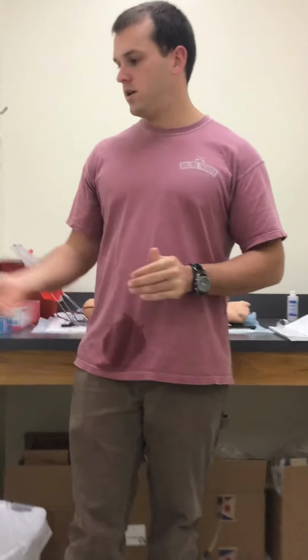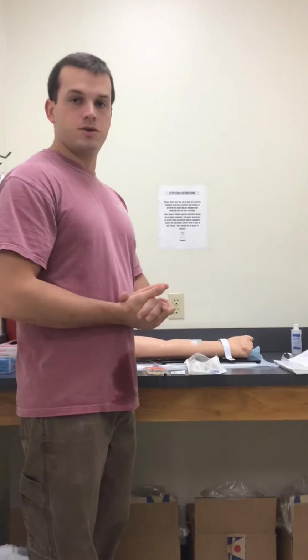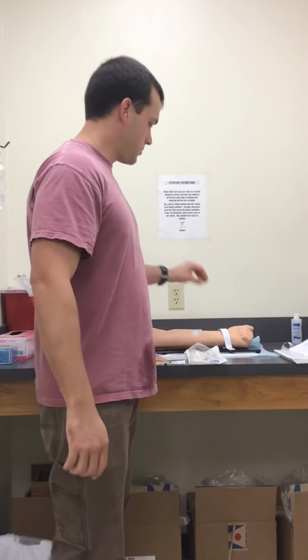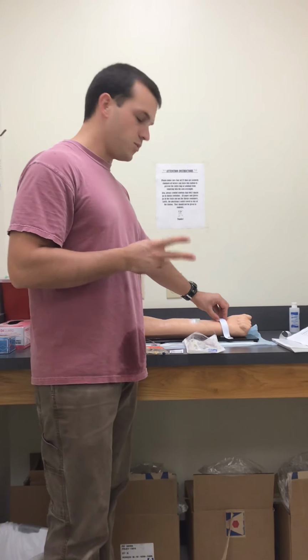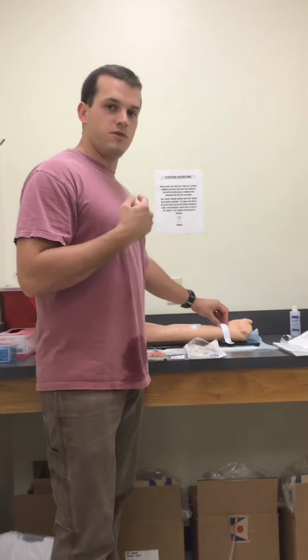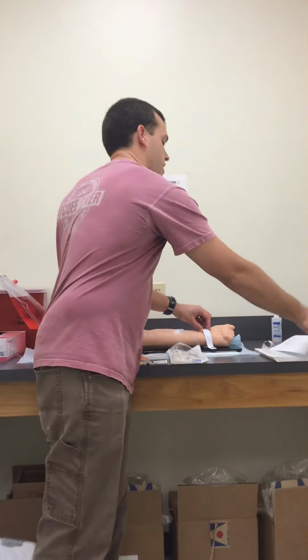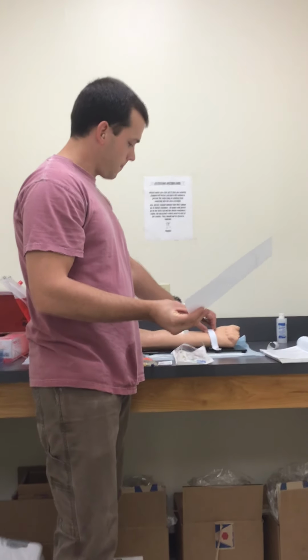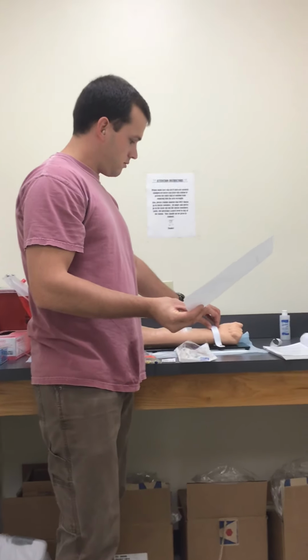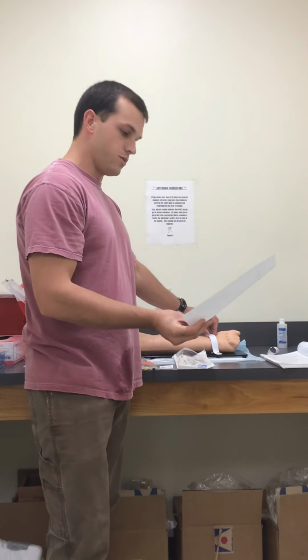I'm going to perform hand hygiene, enter the patient's room, and introduce myself. First thing I'm going to do is check 2 identifiers. One identifier will be his wristband. The second identifier he will give me verbally. I'm going to ask for his name and date of birth, which I should have on my MAR, and it should match with what's on my MAR.